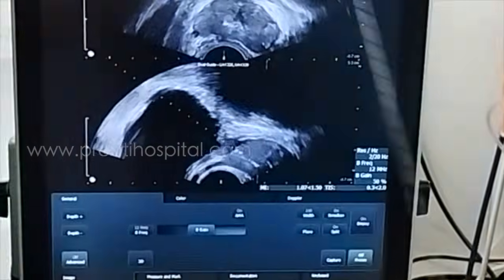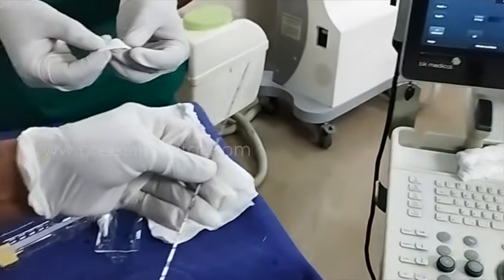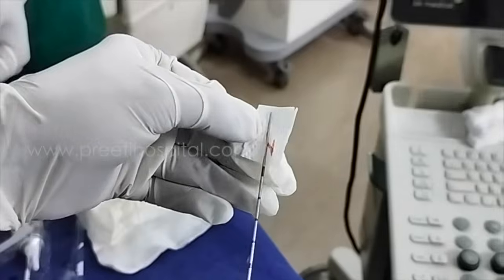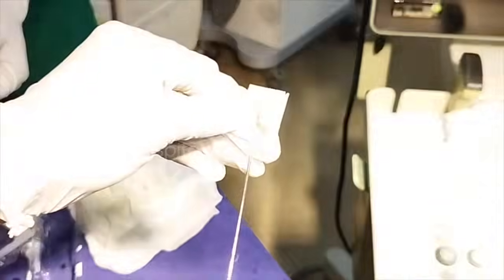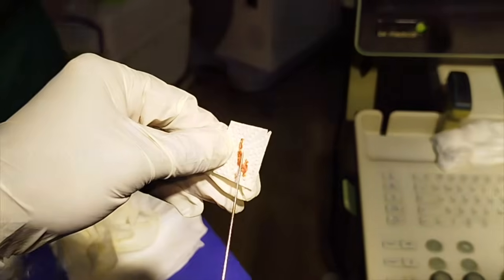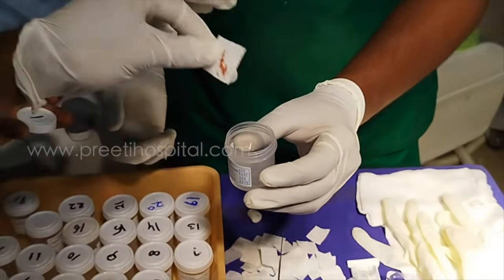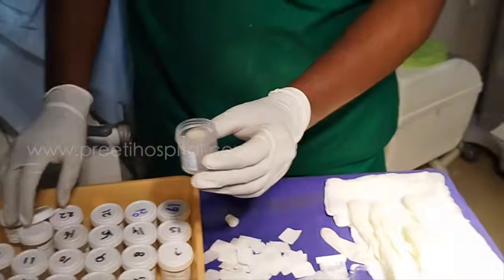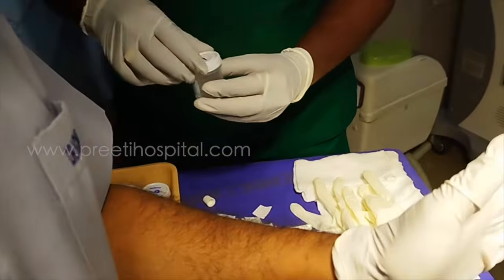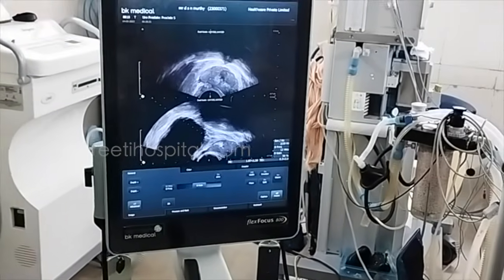Take out. I am taking it out. I am pulling this, and this is the piece which we are showing. Top lights on if necessary. This is the piece which has come. Big piece has come. Can you see this piece? Now I will put it in number 1. Number 1 I am putting into this, and one person will be noting down: base right side lateral.